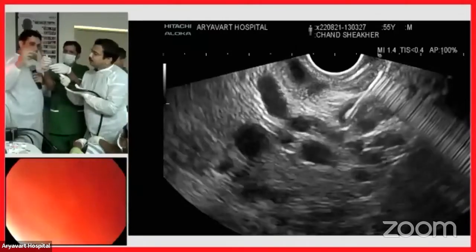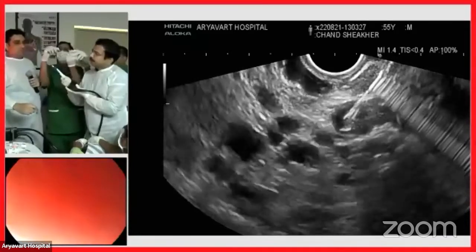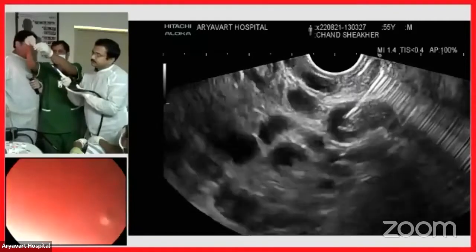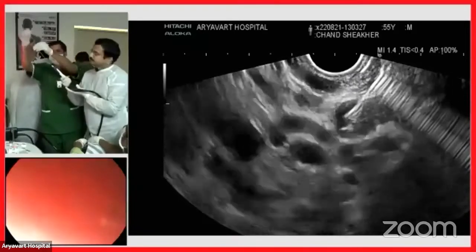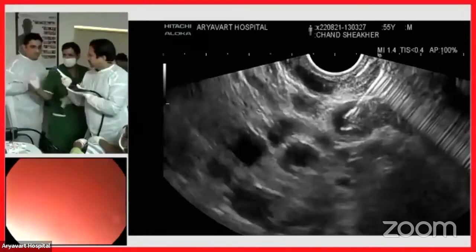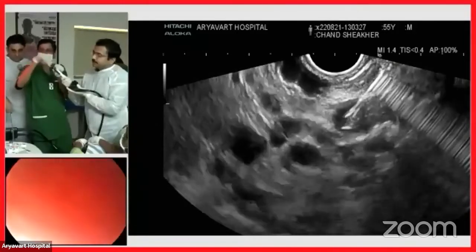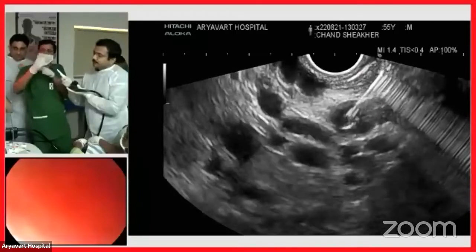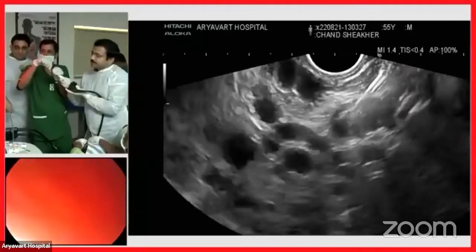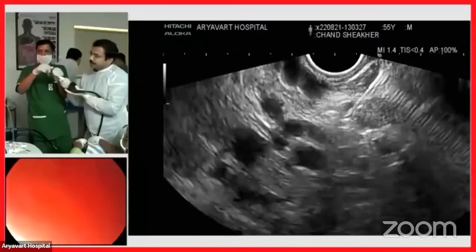This is a 0.035 coil, 14 mm by 14 cm. We push the coil from behind using the stylet. Mr. Ranjit has taken out the holder of the coil and is now pushing the stylet inside to deploy. On US view you can clearly see the coil coming out. As the coil comes out, I slightly pull back the needle to accommodate the coil adequately. The coil has been completely deployed.